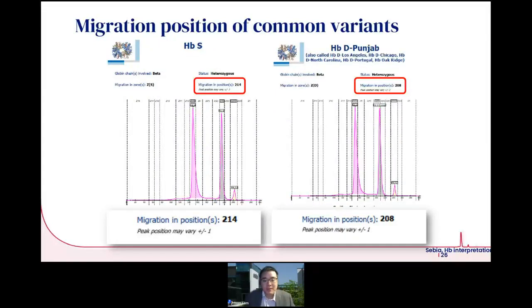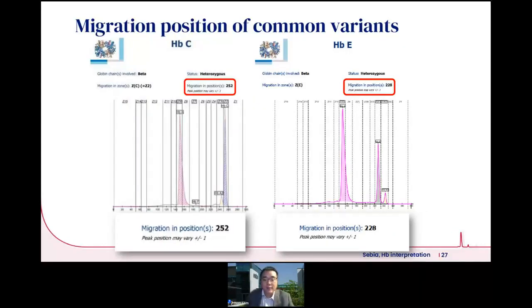Some examples would be for the hemoglobin S. Even though the hemoglobin S and the hemoglobin D Punjab are present very closely, of course, they present themselves as different zones in the electrophoresis software. But if you were to place your cursor at the top of the peak, they give you specifically a different position. For hemoglobin S, it will be 214. For hemoglobin D Punjab, it will be 208. Right? Close but not the same. And of course, with better resolution in capillary electrophoresis, it allows you to separate the bands better so that you do not have the complication of misinterpretation.